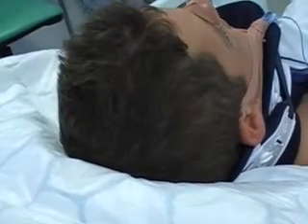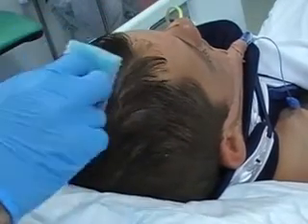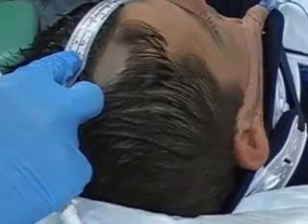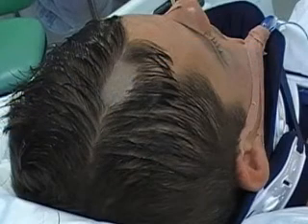Don non-sterile gloves. Place the patient in a supine position and put the water-absorbent underpad beneath the patient's head with the plastic side down. Wash the patient's scalp with soap and clean water using the washcloth or brush. Dry the skin with a hand towel and shave as necessary. Identify the anatomical landmarks and mark the incision site. Generally, ICP monitors are inserted on the side of the non-dominant hemisphere, which is usually the right side.